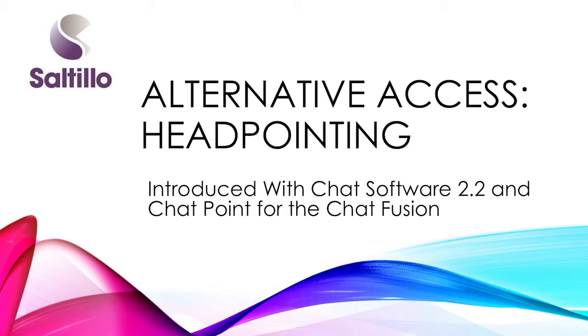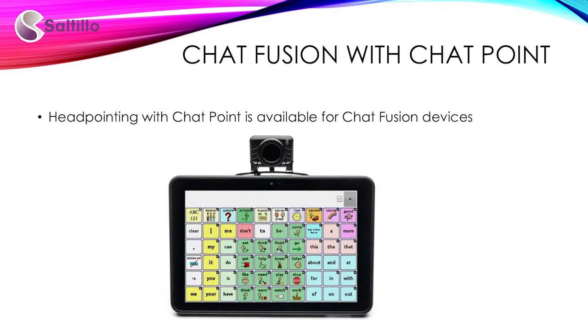This tutorial will explore head pointing with Chat Fusion and Chat Point. Head pointing, also known as head tracking, using the Chat Point from Saltillo allows individuals who are unable to use their hands to use small head movements to control where the pointer moves on the screen. The Chat Point unit mounted on your device translates these head movements into pointer movements and activations or selections on the screen.